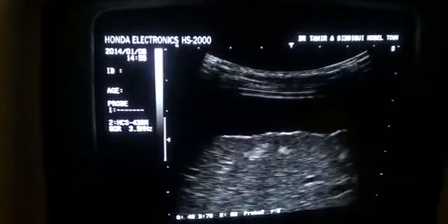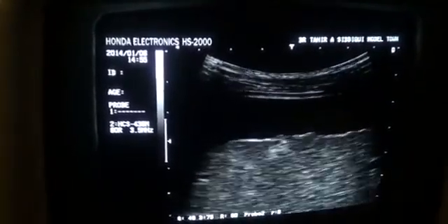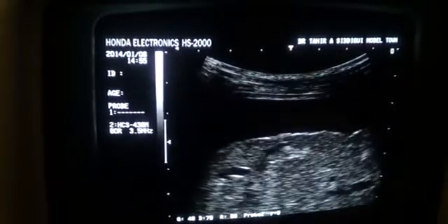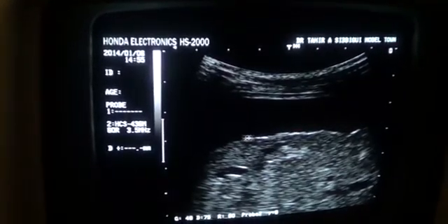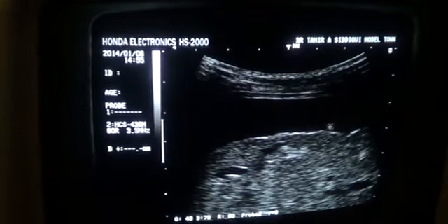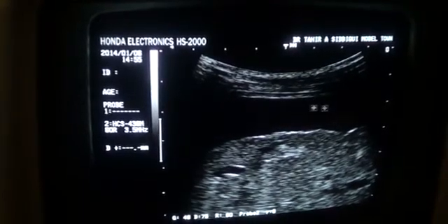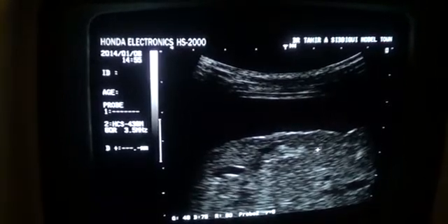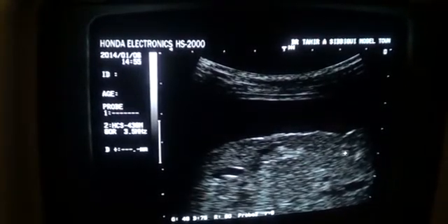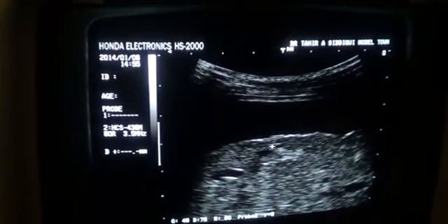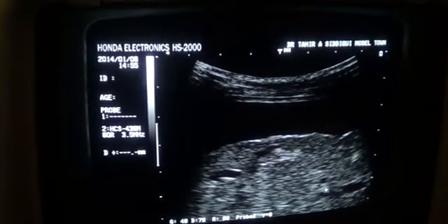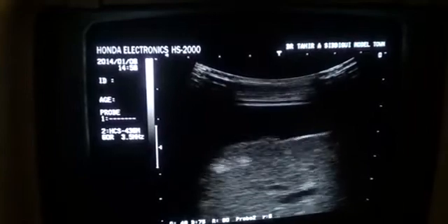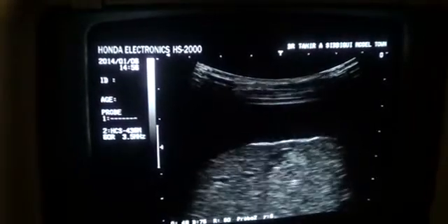The liver is cirrhotic. See the outer surface of the liver — see the Glisson's capsule. The outer surface shows irregularity. This black area anterior to it is the ascitic fluid surrounding its anterior surface. These echogenic areas are suggestive of air in the biliary tree. This echogenic area gives a comet tail artifact, consistent with air in the biliary tree.